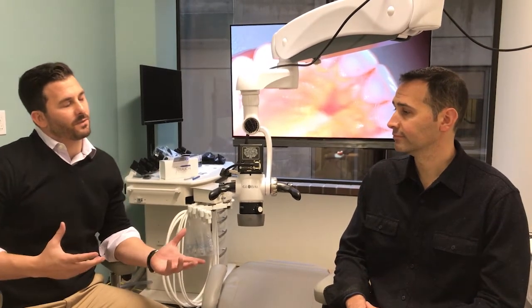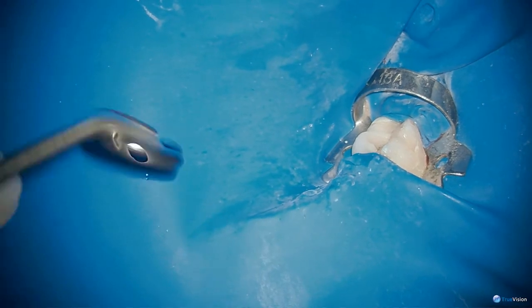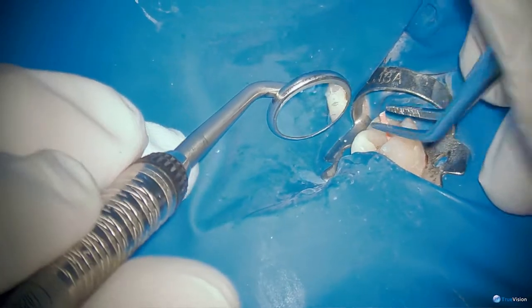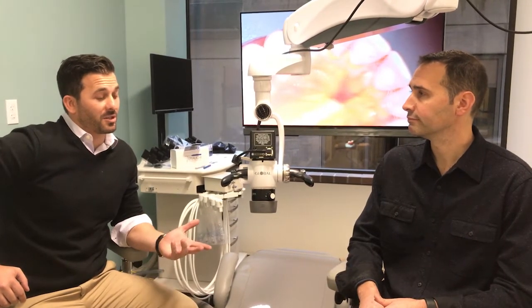When it comes to the depth of field and what you see on the screen, is it comparable to a microscope? Is it better? I think it's at a minimum comparable and probably a little bit better. Ergonomically, it's not as hard to adjust the focus — you're not leaning in and trying to adjust your body to focus it. You just adjust the microscope, so the visual perception is probably a little better.